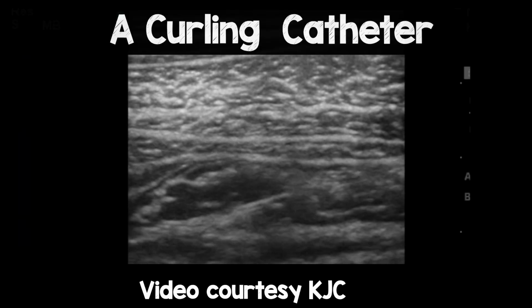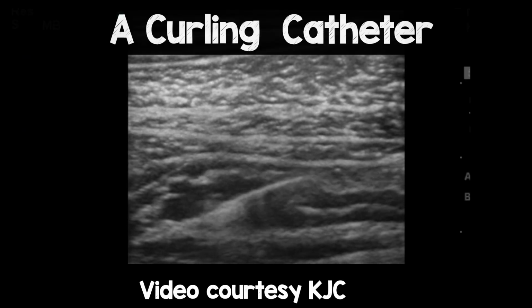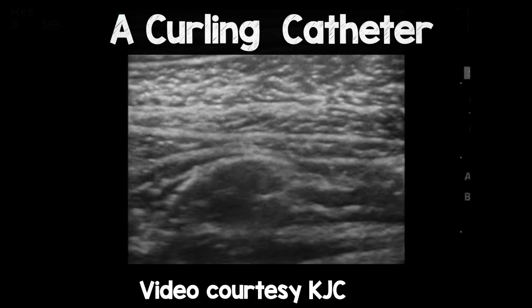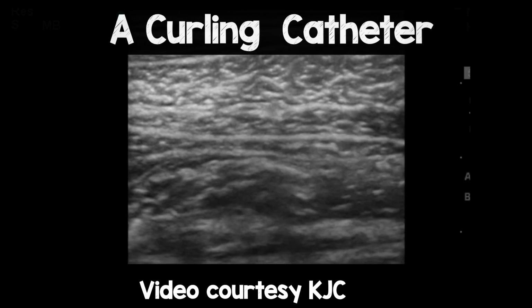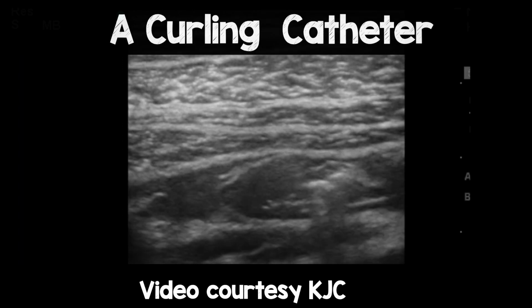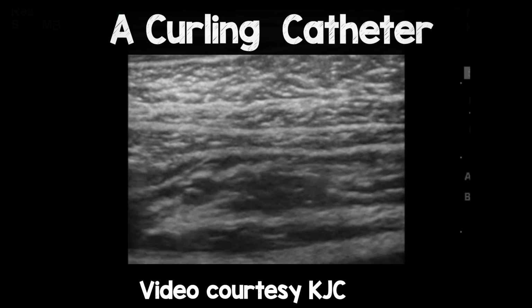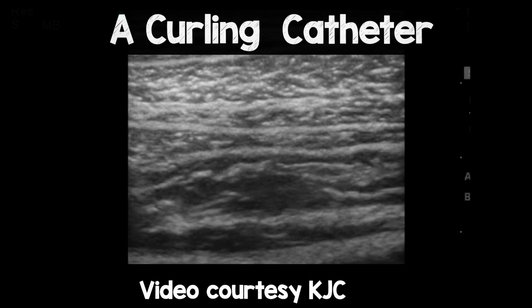If you want to see what it looks like to have a catheter curling as you're siting it, here's another video by Keijin Chin of threading the catheter. You can see the catheter's curling in the tissue here. So if you thread too much catheter, this is what can happen. But some people use this technique intentionally to get the catheter to curl and stay in a particular area. But this is certainly not an easy technique.